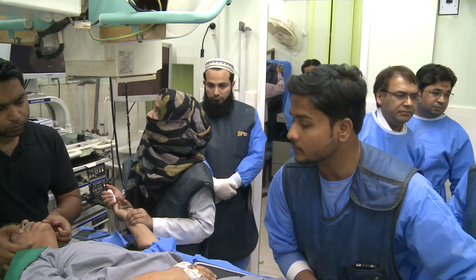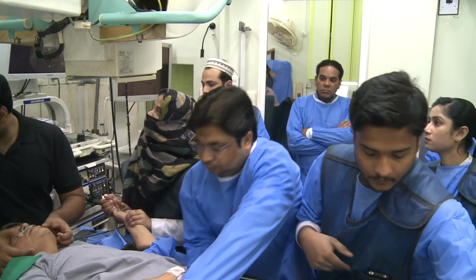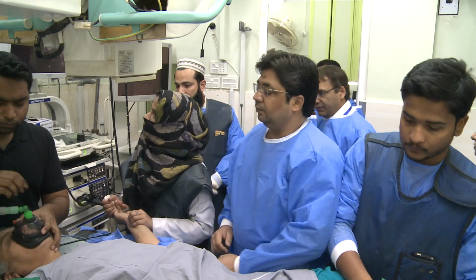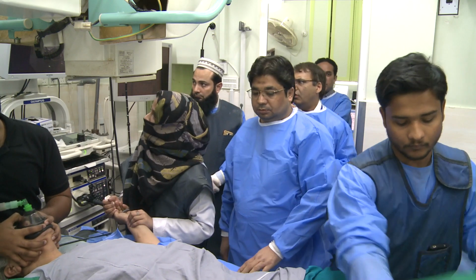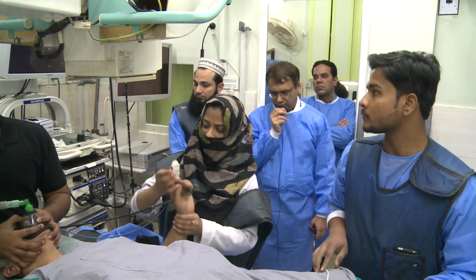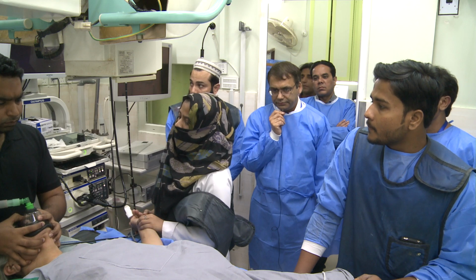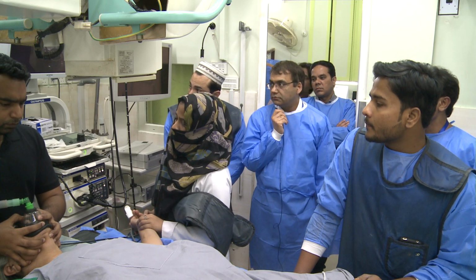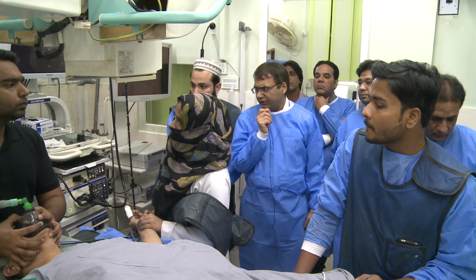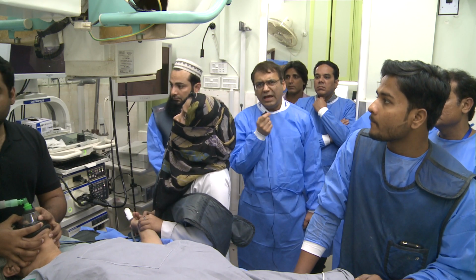So, Khalid, can you hear me? Yeah, I can hear you. So we have normal LFTs, but abdominal pain, with right hypochondriac pain, MRCP showing dilated CBD 8.1, EUS showing no mass and no stones. I couldn't see any. And again, distal dilated CBD till the distal end, but normal LFTs. So we're suspecting papillary stenosis. Possibly that was one of the possibilities, but I am also concerned about possible SOD. Yeah. So the same thing.